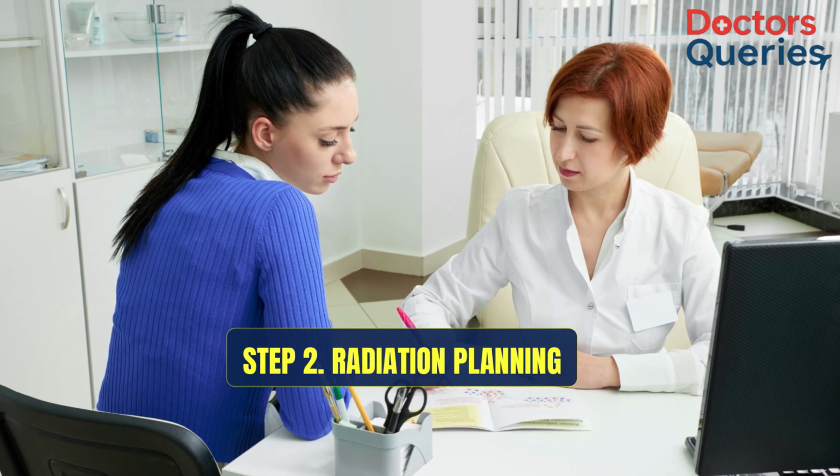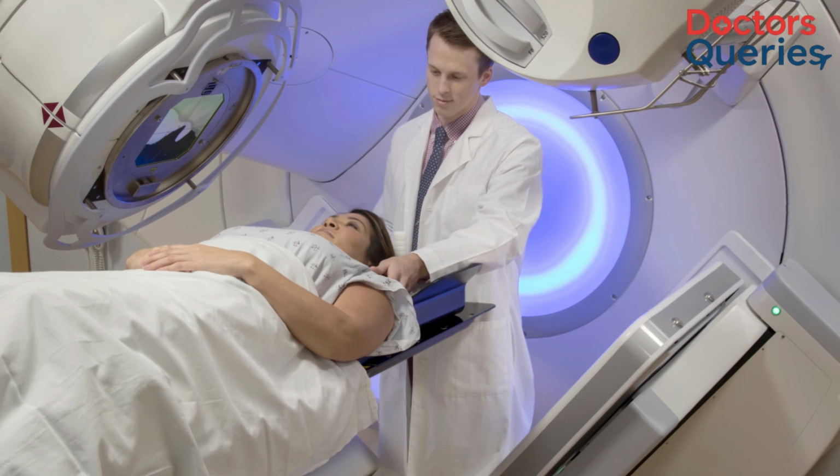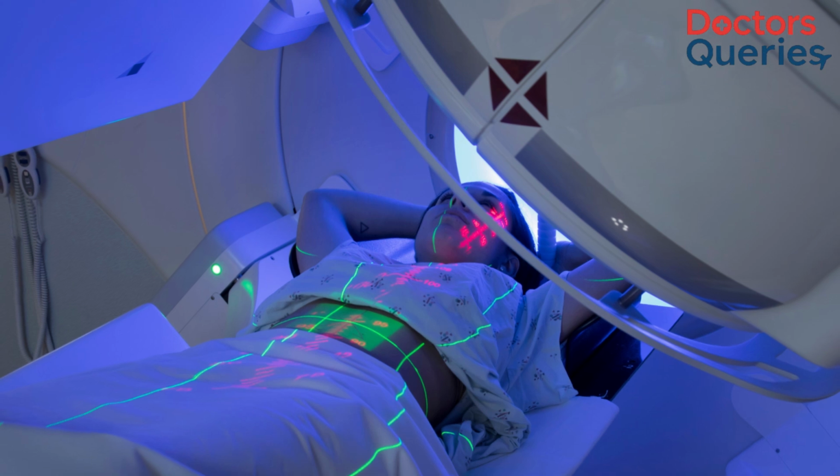So, the second step is the radiation planning, which is done a few days after the first counseling. The day the patient is called for radiation planning, we tell the patient that it will require about 1 or 2 hours in the hospital. The patient lies on a simulator. A simulator is a machine which looks like the treatment machine. It is on this machine that we take the image of the patient in the treatment position.